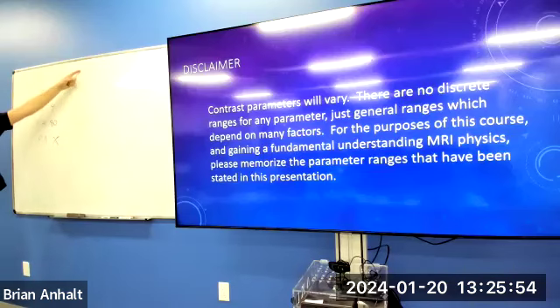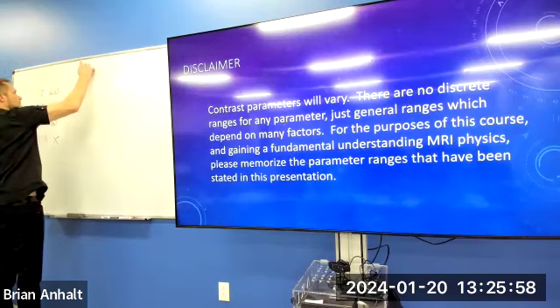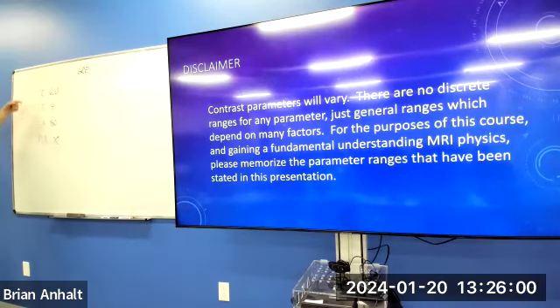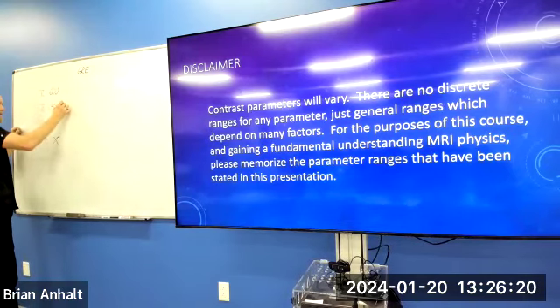Gradient echo. Yep. This is telling us that it's a gradient echo, right? There's no refocusing angle, and the flip angle is less than 90. Most of the time it's going to be less than 90. Now we're looking between this. We don't worry about that. Is this short or long for the TE in the gradient echo world? Short.